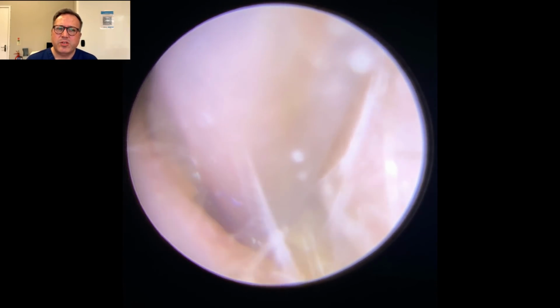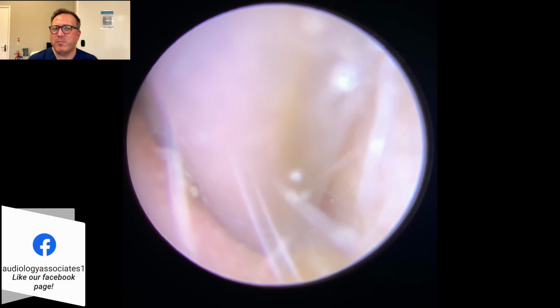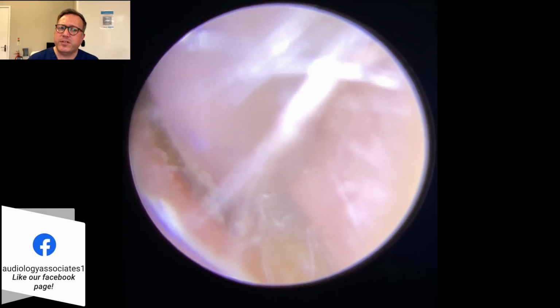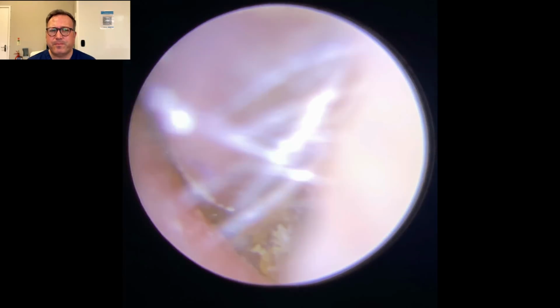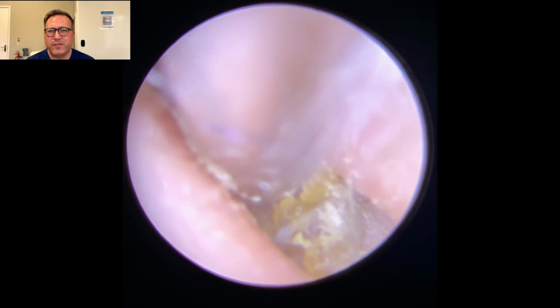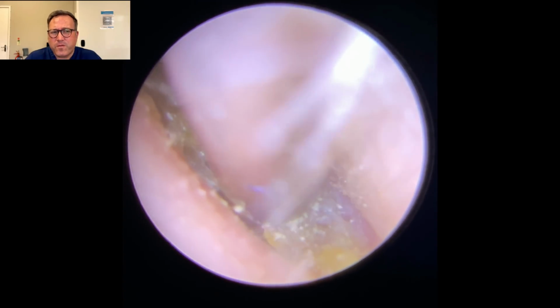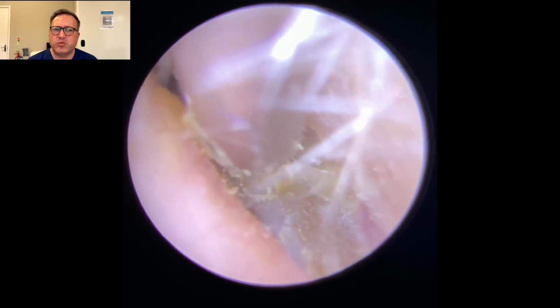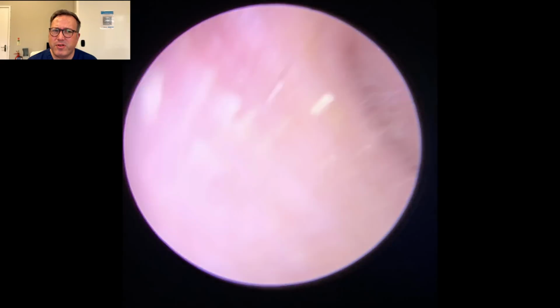So this ear canal now, the patient didn't realize that this ear canal had wax in it, so they haven't really prepared this side. No olive oil's gone in here at all, and you'll be able to see the difference in the wax. Now, much drier type of ear wax here, just lifting from the corners. You can see how it's firmly stuck, it's dried onto the canal wall here. So I'm just trying to maneuver this and trying to unstick it, but it's stuck pretty firm.